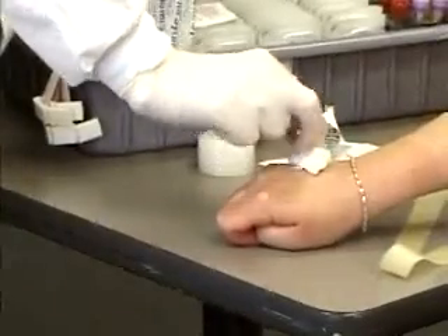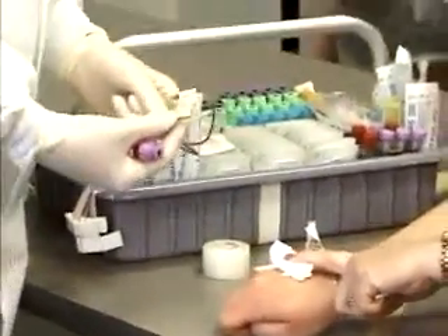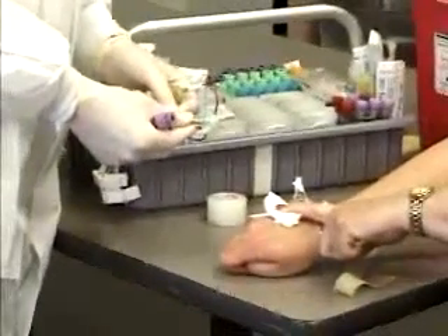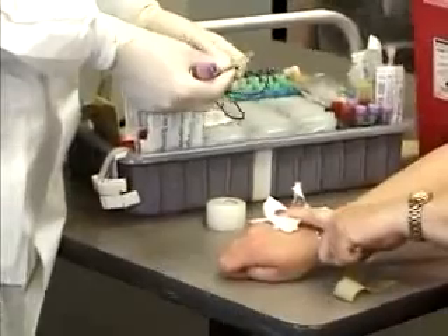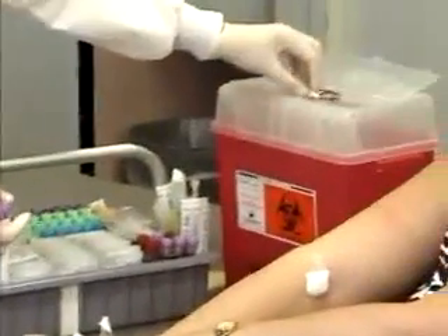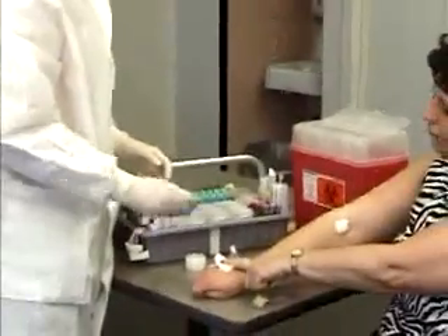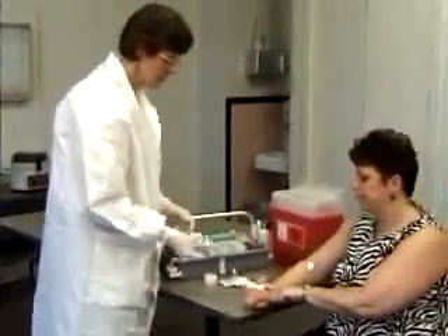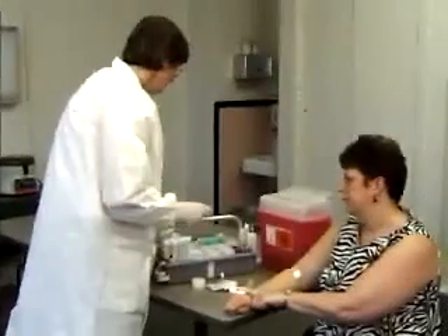Ask the patient to hold pressure. Slide the safety device forward so that the needle is covered, then dispose of the whole device into a sharps/contaminated box. Mix the tube to make sure it's well mixed, then label the tube.